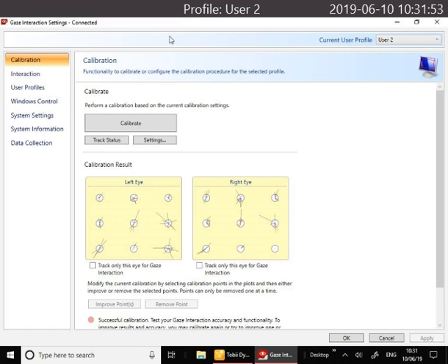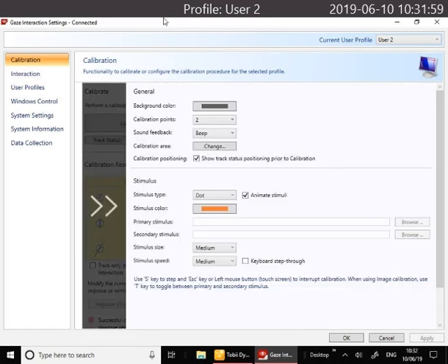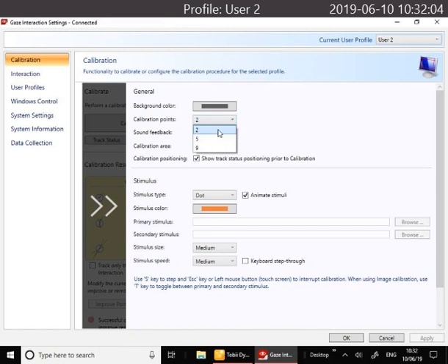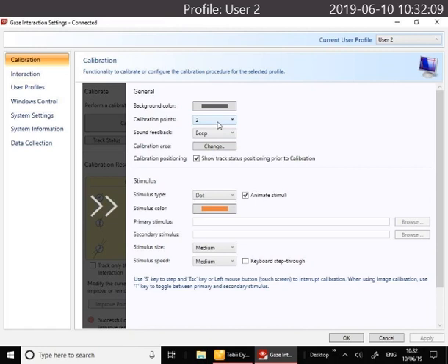You've got some settings here for the calibration so we'll click there. You can change the background color, you can change the number of points that they have to look at during the calibration, so you might like to start with two. You can change what they're looking at, so at the moment it's a dot but you might like to choose an image or a video, something favorite of the person.